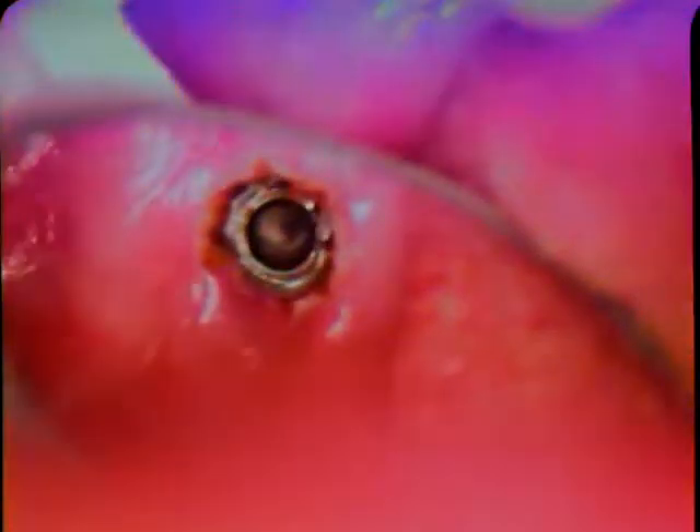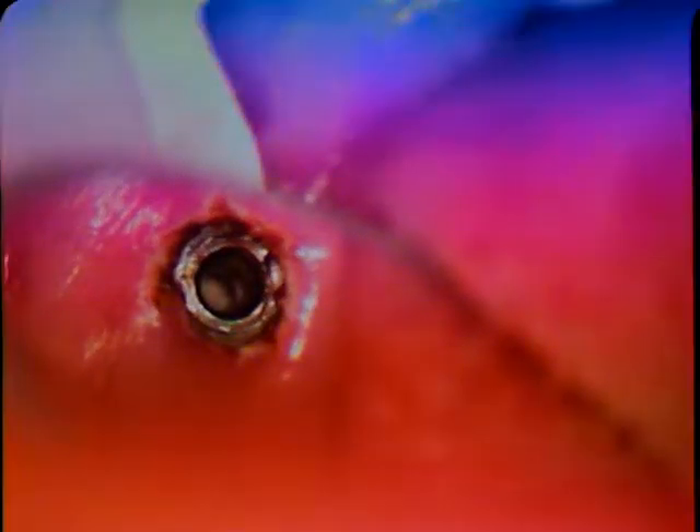Let's go in and see if we can put a little bit of pressure on this fractured abutment — see if it comes out without any drilling. That's my hope: to do it in a conventional way versus a drill-out method. We're back in the mouth. We're going to introduce the instrument and wiggle it back and forth to see if we get any micro-movement. Turn it a little bit, wiggle it a little bit, just to see if anything were to come free. And obviously nothing there. We've been down this road before many times, so we're going to move forward with this operation.